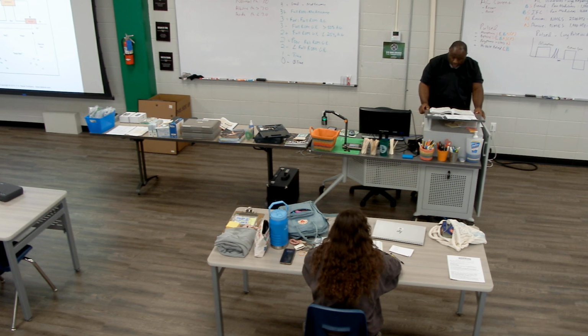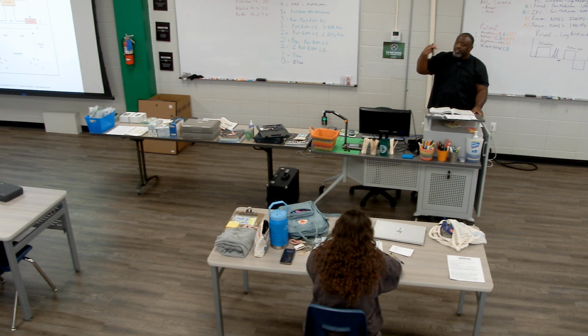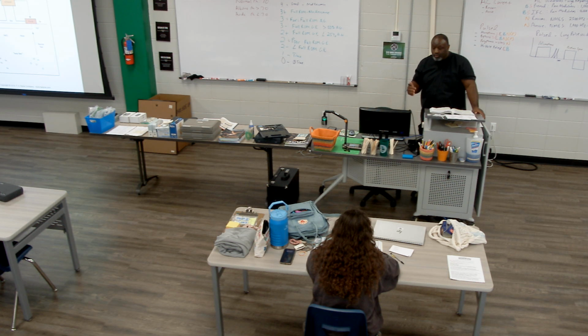Large charge accumulations occur when the current is too strong. Meaning, instead of just having a small amount, we'll get large accumulations of it, and that's when we get skin breakdown. We're starting to get burns or breakdown underneath the skin when we have too much charge.